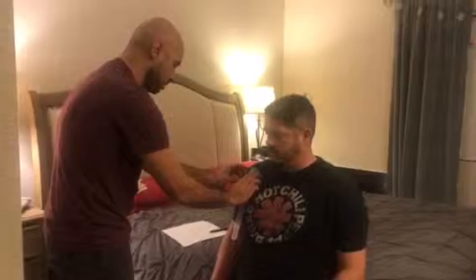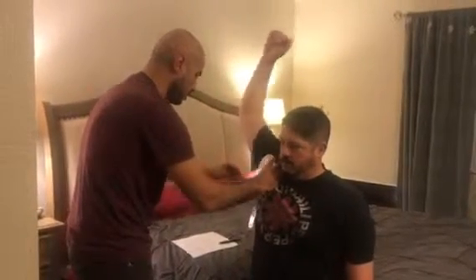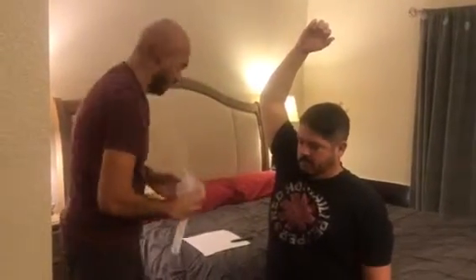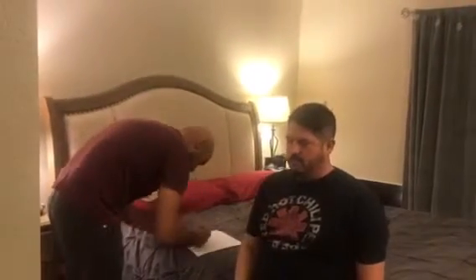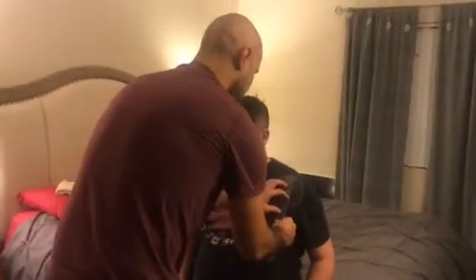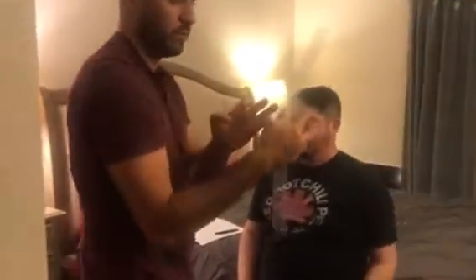Next one is going to be shoulder abduction. We're going to put the fulcrum right at the acromion process right here. You're going to raise your arm up and as far to the side as you can go. About 145. Going to do the same thing — and go. This one's going to be 155.